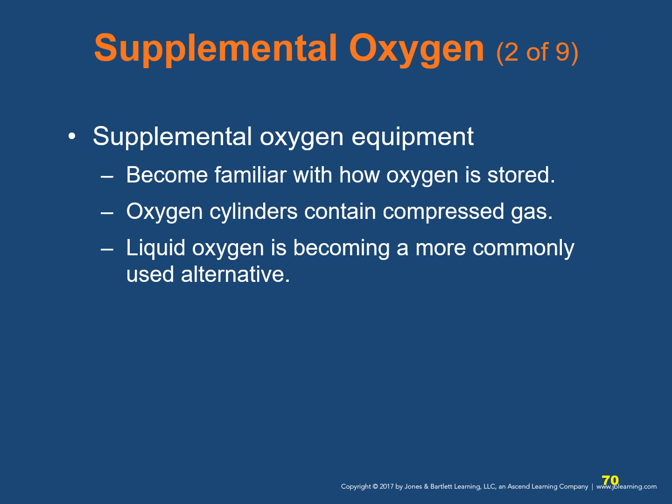Most often, the D or Jumbo D and M cylinder sizes are used and can be carried from the unit to the patient. The M tank remains on board as the main supply tank. There are other sizes: A, E, G, H, and K. In an alternative naming system for identifying the size of the oxygen cylinder, cylinders are labeled with M for medical, followed by a number. The length of time you can use an oxygen cylinder depends on the pressure in the cylinder and the flow rate.